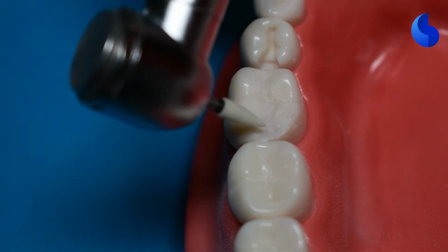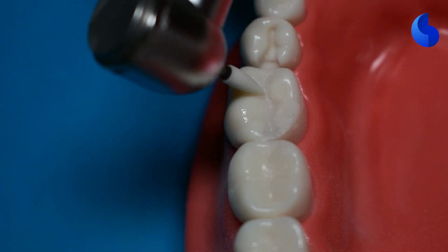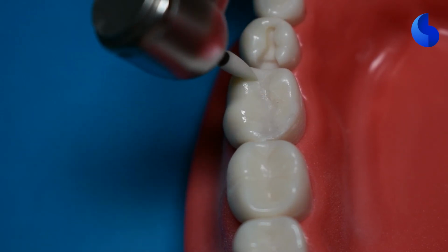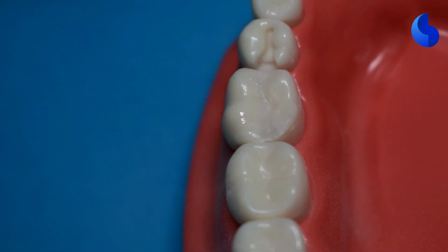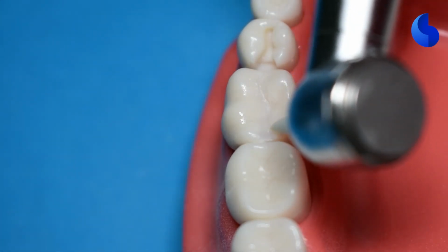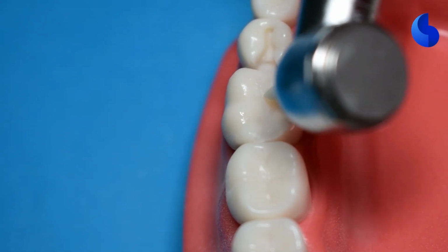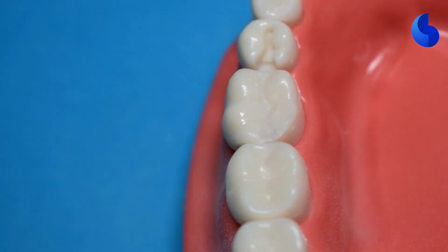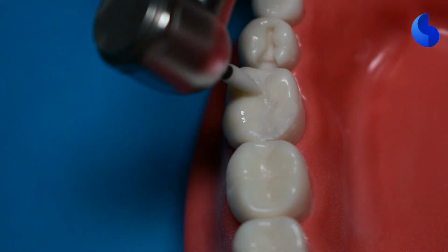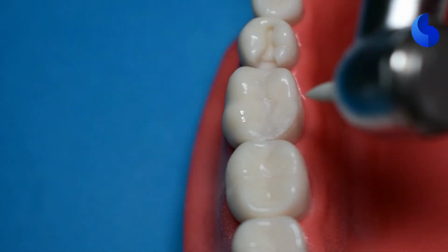And then we can use our favorite instrument, which is the white stone. Start using your white stone to remove any fine scratches that you would have left behind with your finishing diamonds. And use this to further smoothen your restoration, having it flow with the natural occlusal anatomy, and making sure that your marginal ridge is not sharp, it's smooth and rounded, and at the same height as the adjacent tooth.